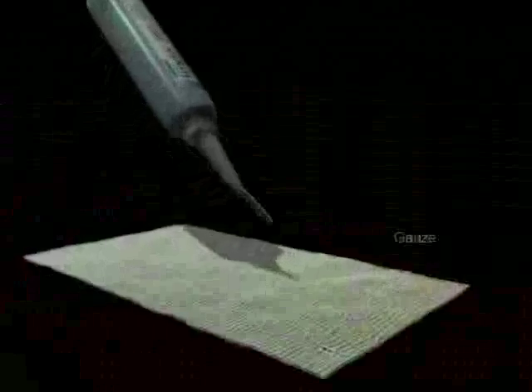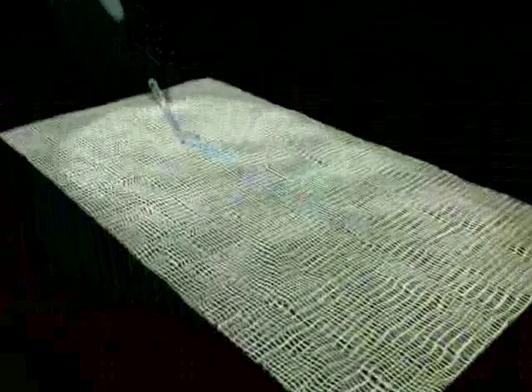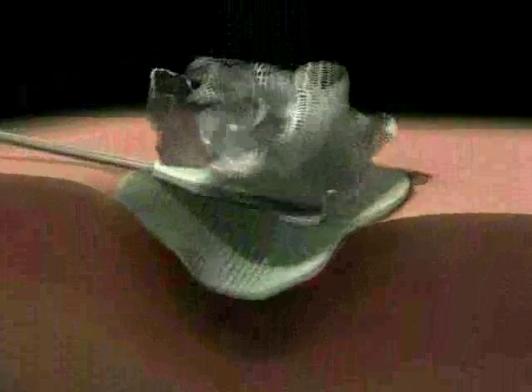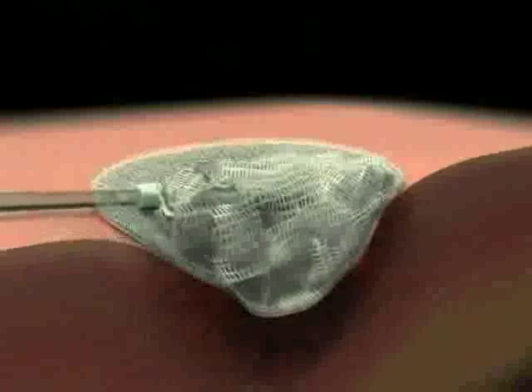Following the placement of the drain, prepare an appropriate amount of gauze and saturate with saline as provided in the Invia dressing sets. The gauze is then fluffed to fill the wound space to skin level. Medela supplies antimicrobial gauze for use with Invia Wound Therapy to prevent bacterial migration throughout the wound and to help maintain the delicate wound environment.